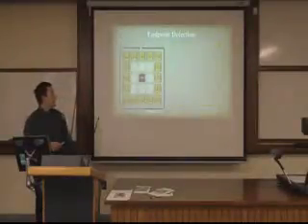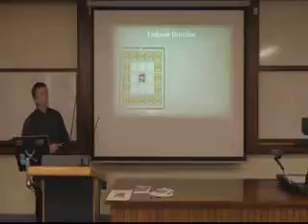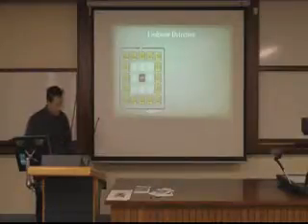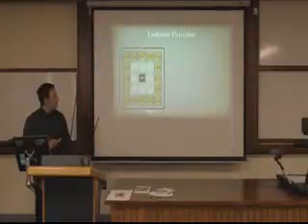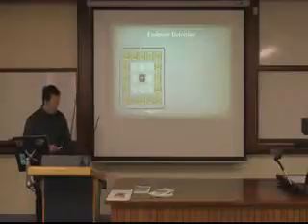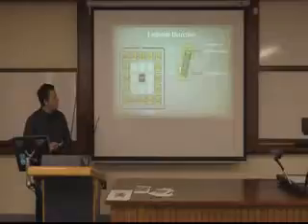And then I created an original, so this is an original idea of detecting endpoints. So once you have your pixels of interest, this is now operating on the component labeled binarized ROI. So it's technically not binarized because there's more than just two values. And you search the 16 pixels around your pixel of interest, and you compare if they have a value the same as your pixel of interest, you give it a value 1, if not a 0. And from that, you create bit sets that encode the region around your pixel of interest.